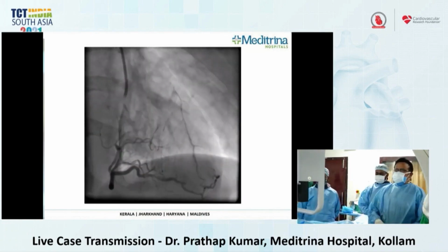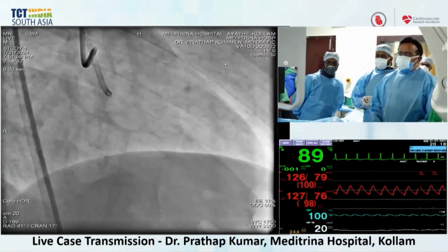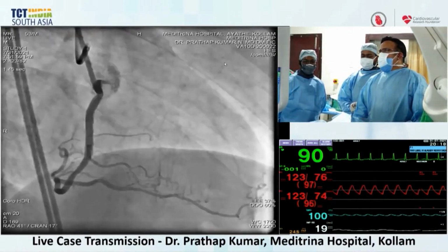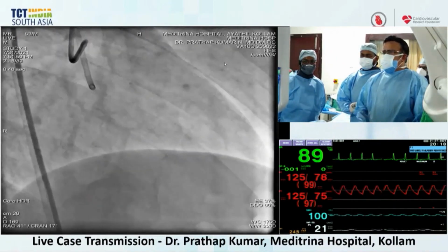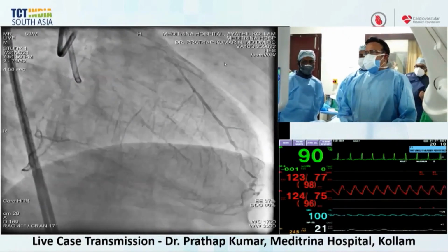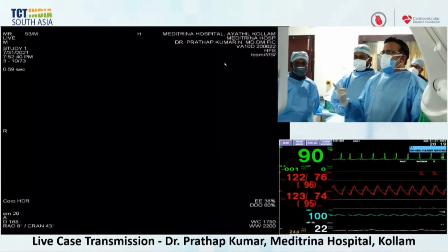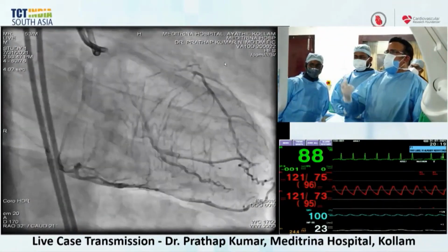Can you just show the angiogram today? We were thinking that we would be doing a retrograde CTO intervention and demonstrate that. But you can see minimal flow from the antegrade, while the retrograde is excellent. It looks like there's a connection there. Excellent connection. So we actually took a right coronary catheter. Excellent connections and multiple collaterals.